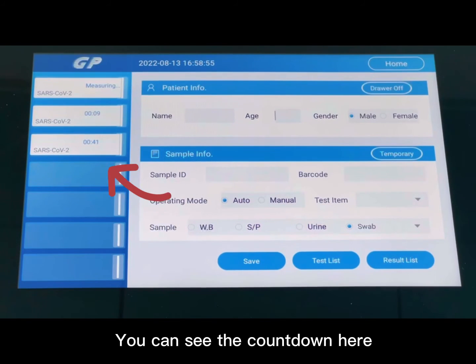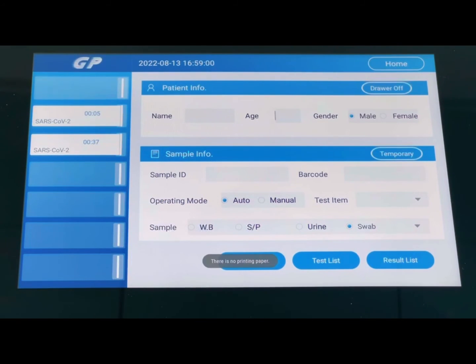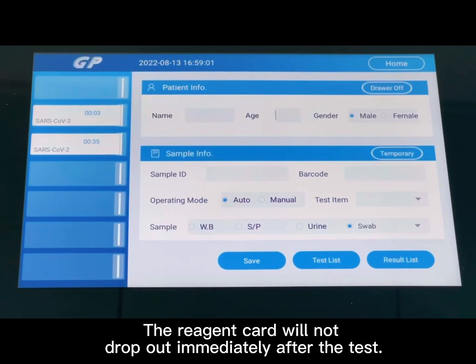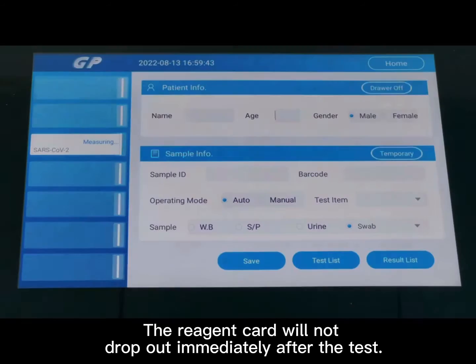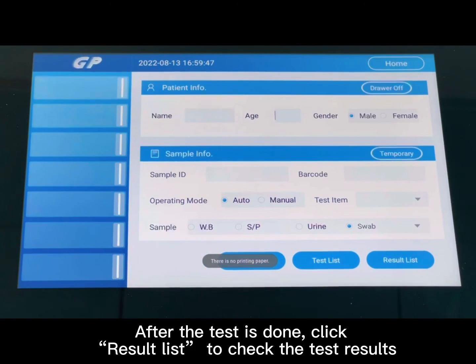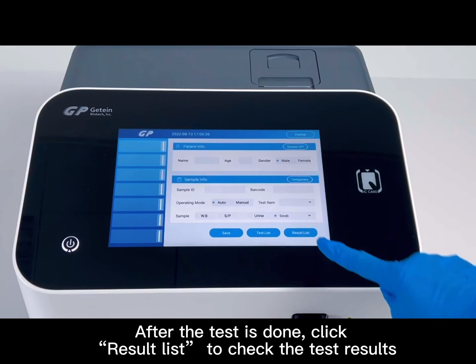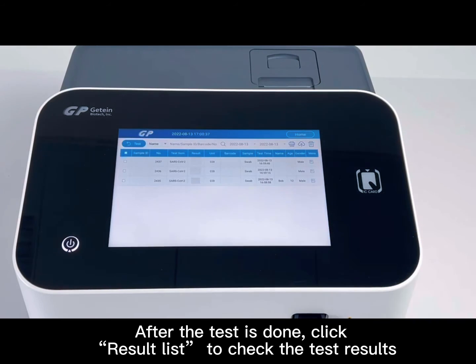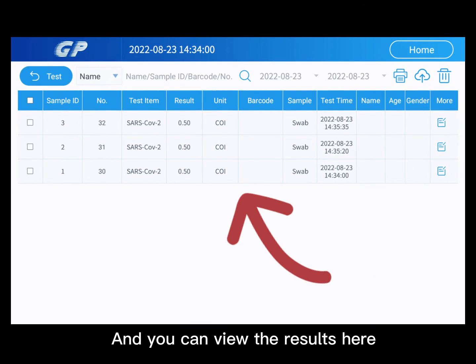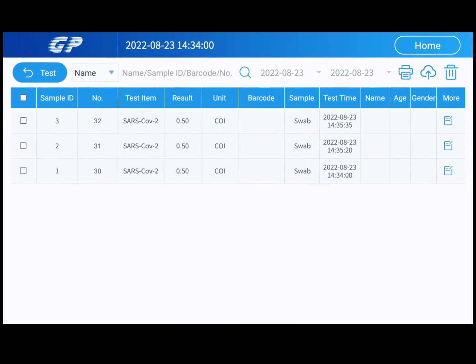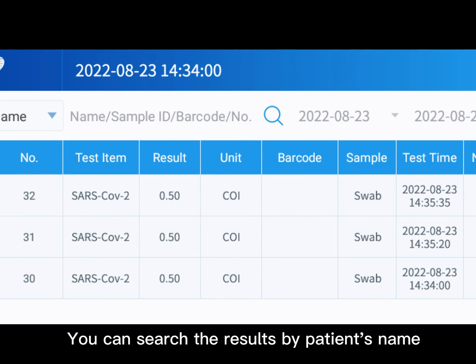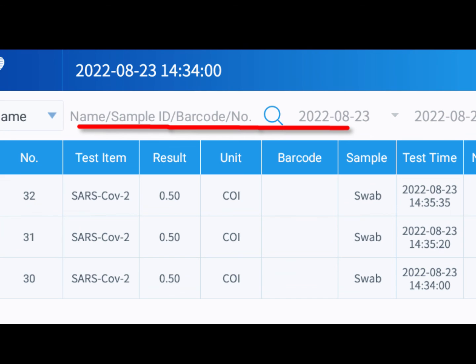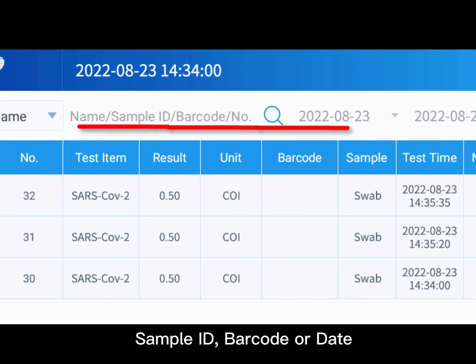You can see the countdown on screen. The test card will not drop out immediately after the test. After the test is done, click Result List to check the test results and view them on screen. You can search results by patient's name, sample ID, barcode, or date.